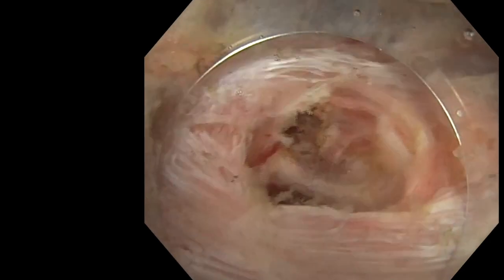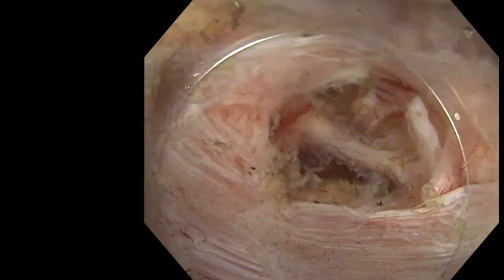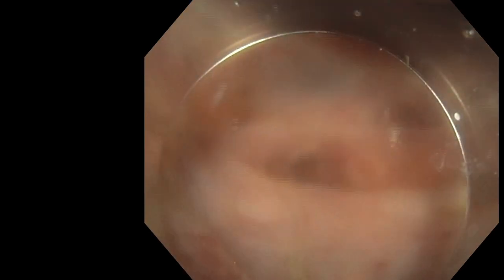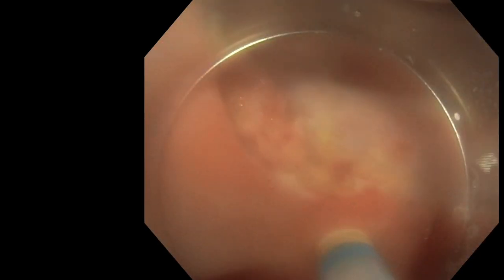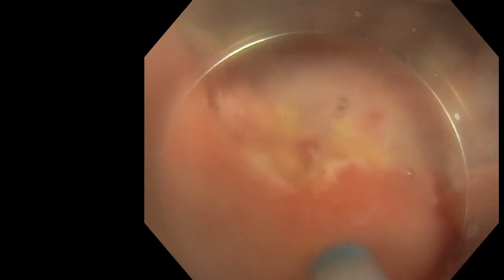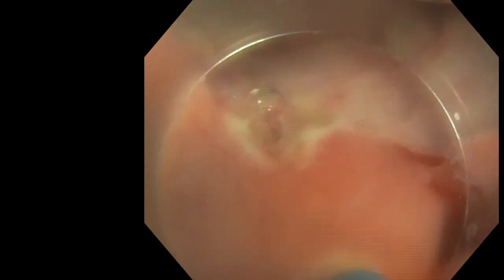There is a layer, it's not free, we are not in the peritoneum, and we could close it completely thanks to a small incision all around, because I like to do this incision to have a better grasp of the edge, without the clip sliding on the edge of my resection.